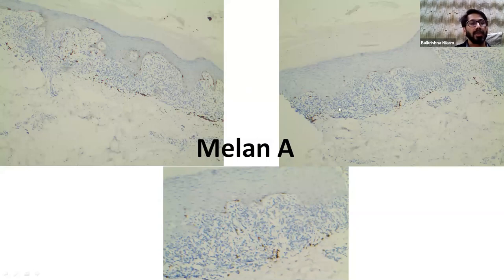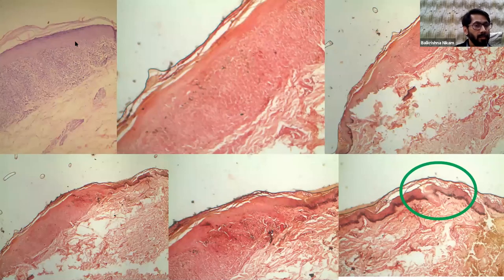I'll show you the excision biopsy. Now this is an excision biopsy which includes the normal skin also. So this is lichen planus histopathology. And you see the Fontana-Masson stain, it's lacking all the pigment here. You can see some of the pigment, which are the melanophages, in the Fontana-Masson stain. You see the normal skin and here there is lichen planus. So this normal skin is showing epidermal pigmentation. You agree? See, this is another side of the normal skin. You can see the epidermal basal pigmentation is totally lacking in this epidermis of lichen planus. This is a closer view. You can see there is no pigment in the lichen planus epithelium and the pigment starts here.